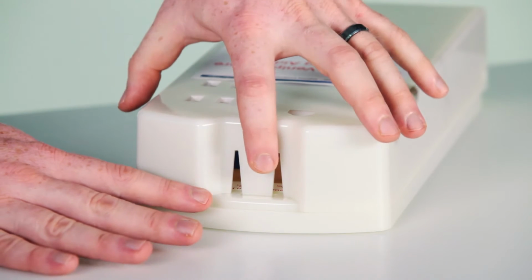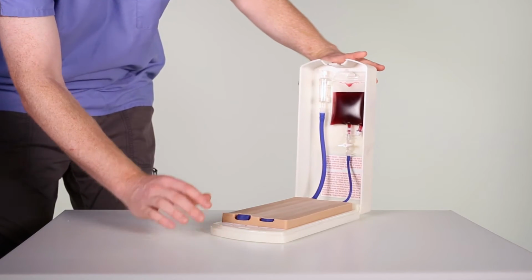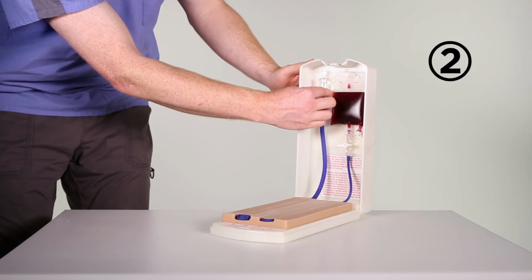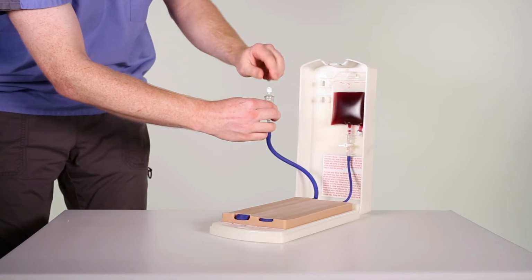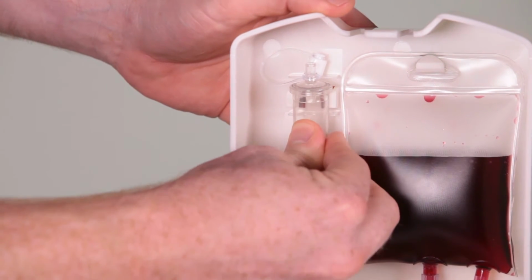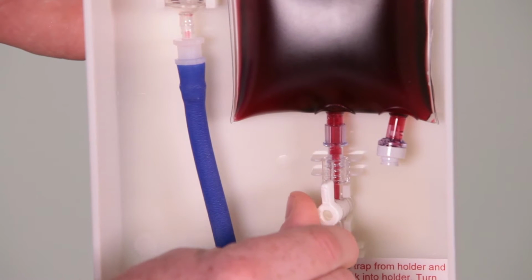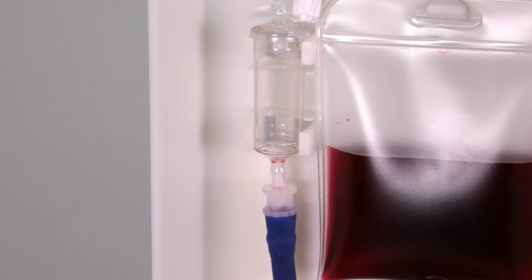Quick and easy. Push the tab and lift to open. An audible click confirms when top is in the upright and locked position. Remove bubble trap from holder and unscrew cap. Replace bubble trap and an audible click confirms proper placement. Turn the stopcock 90 degrees to start the auto priming of the simulated blood. When blood is observed at the base of the bubble trap, the model is ready for use.